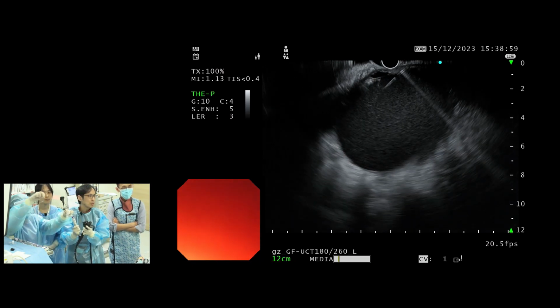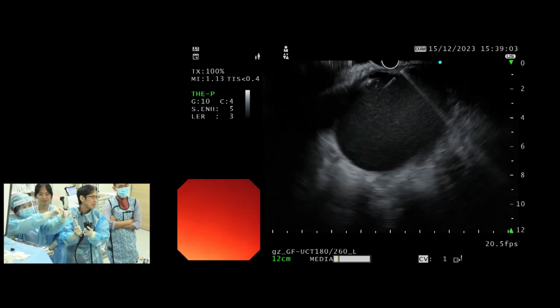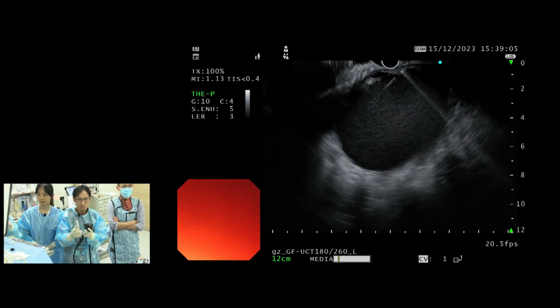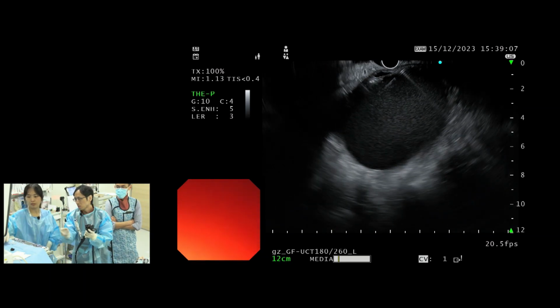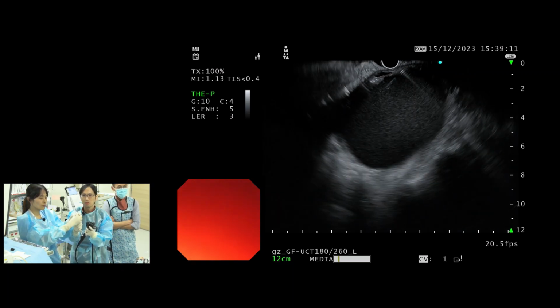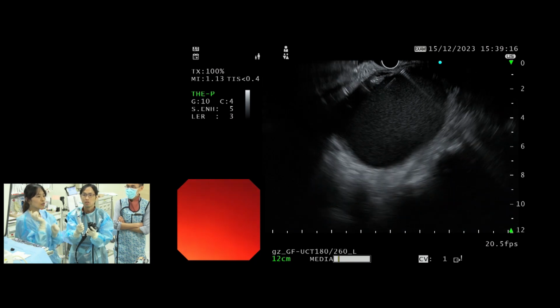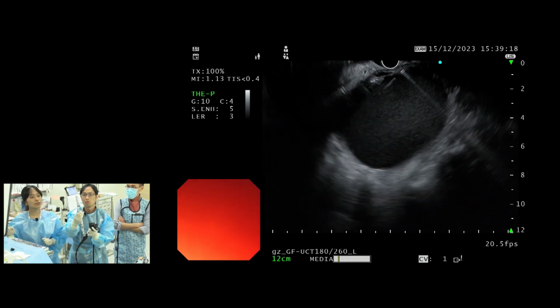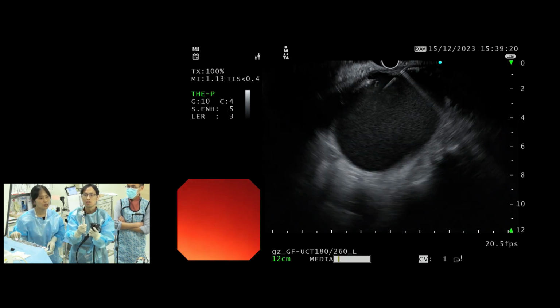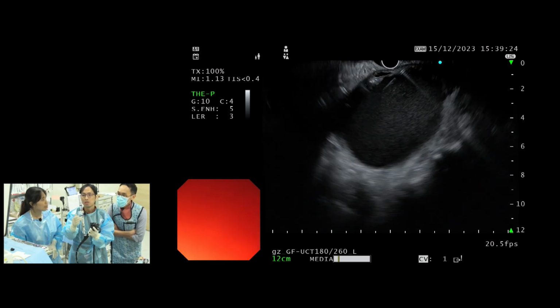But we have an HPB surgeon here, so we're talking about it being probably unlikely to be a pseudocyst, right? Yeah. Now we're going to find out what the fluid looks like. Of course, just now we were trying to say what kind of fluid analysis we'll do. I think Raymond is correct. First of all, the appearance of the fluid actually matters.